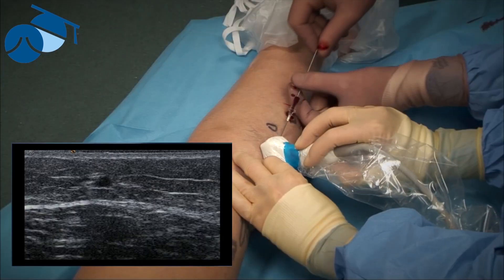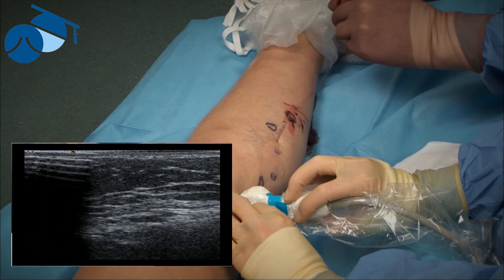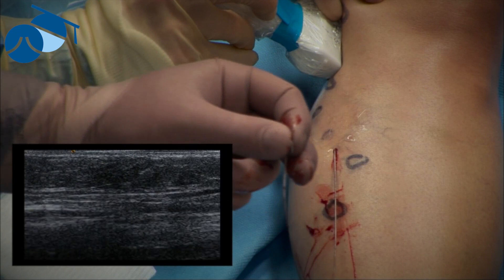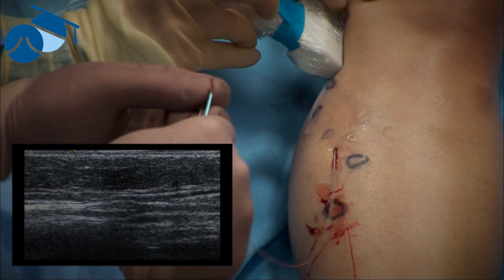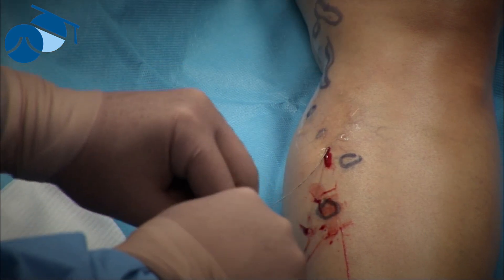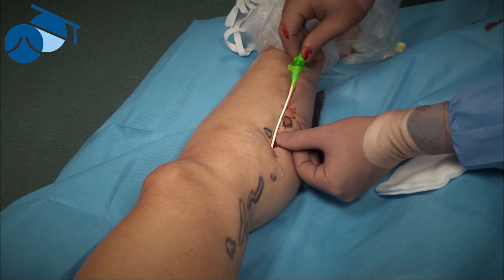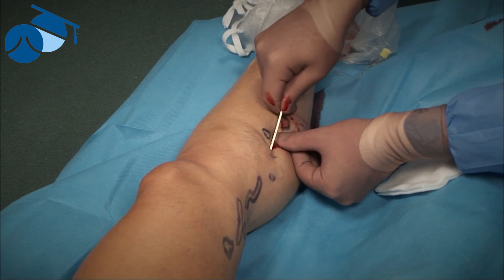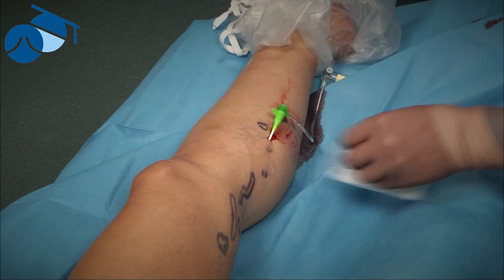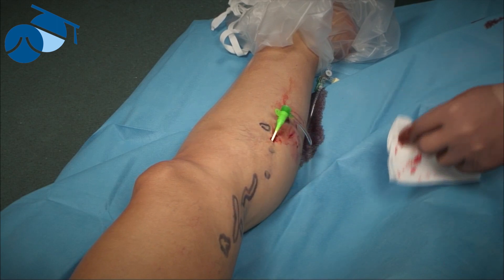We pass the wire up inside blunt end first, without the curve, because the vein is too small to pass the curved bit — and as suspected it doesn't go very far because of the missing great saphenous vein. We then come in with the dilator and, using the Seldinger technique, pass straight into the vein itself. We have now cannulated the bottom of the great saphenous vein and have access. Of course, what we haven't done is close the sapheno-femoral junction, and we couldn't do that from there, so we move further up.